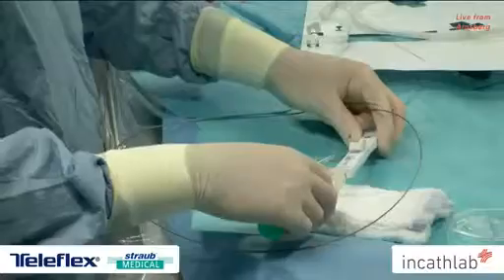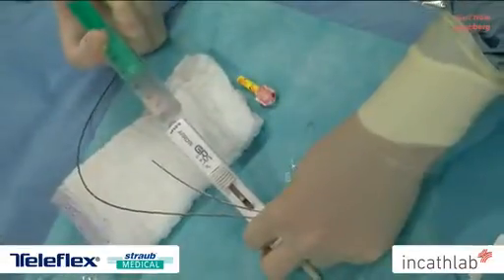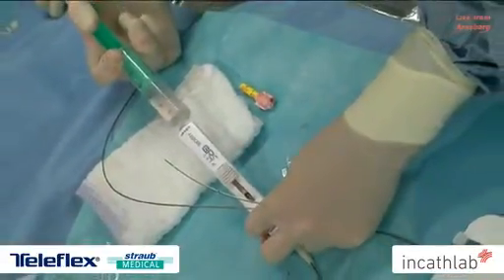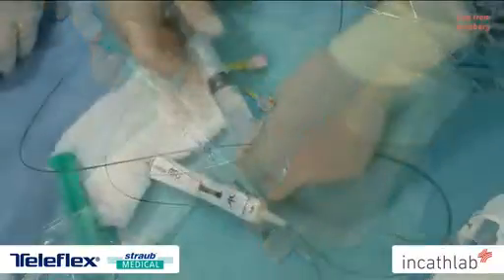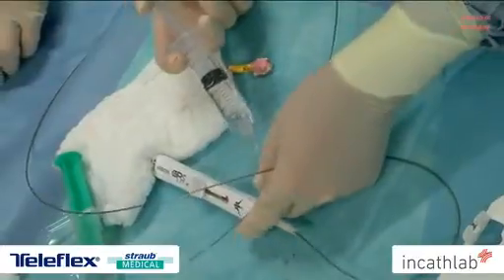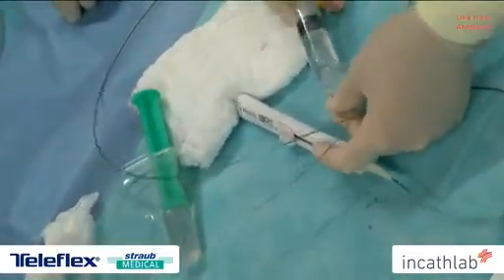where it was possible to find a re-entry door for the anterior tibial, and as a next step, a re-entry door for the peroneal artery. Maybe you can briefly comment on the catheter.